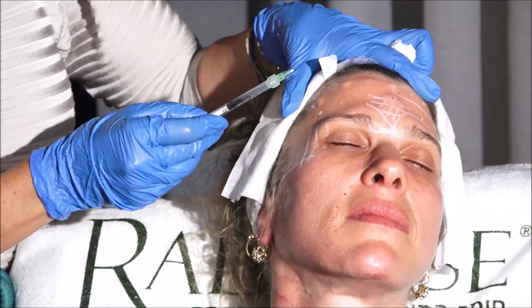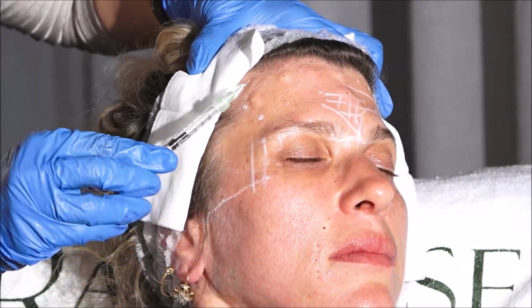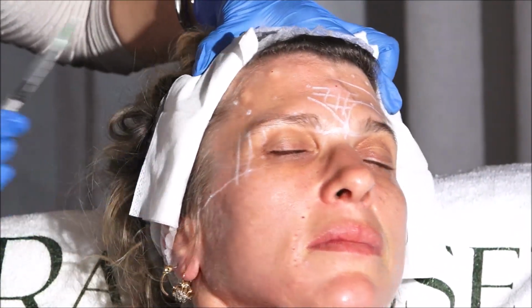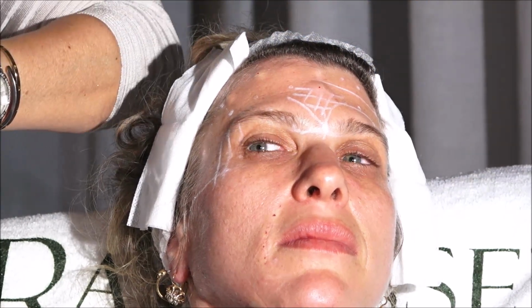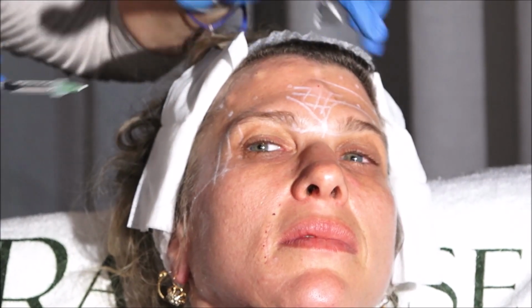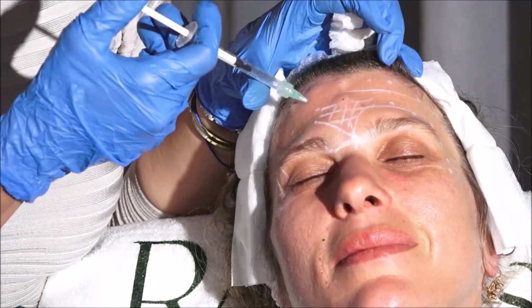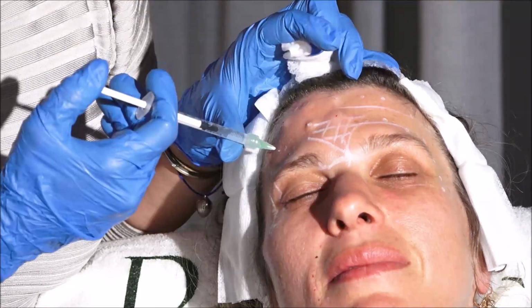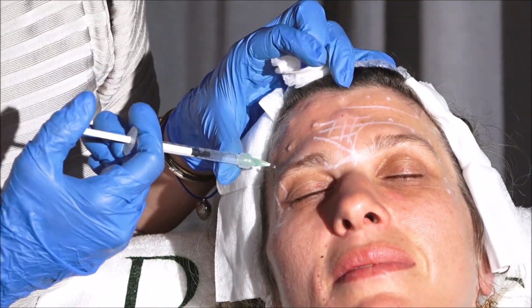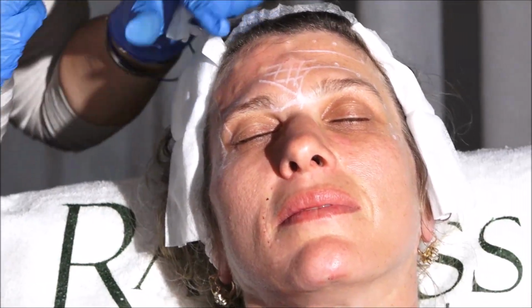I want you to look at this. You see the oval shape? Let me put her like, you see the oval shape here? This is, when you are in the muscle, one of the things you can see when patients have thin skin is the oval shape of the bolus, illustrating the diffusion that the guy showed in the paper. On the other hand, if you see a round, maybe you're in the subcutaneous. But, so here I'm gonna give 1 unit, 1 unit, 1 unit. This is how I would do her forehead.